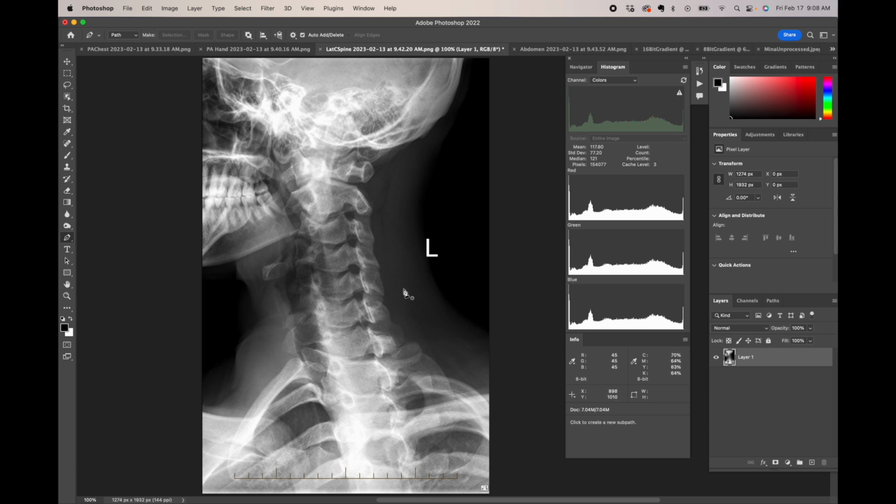If I go to the center, soft tissue area, we're at 45. Right there, 191. So again, this spike is showing the black area of air that's out to either side of the neck. Right there is pretty dark, that's at 25. That value is a good value for me to mention because around 20 to 25 is considered black with detail when you're dealing with images in Photoshop.